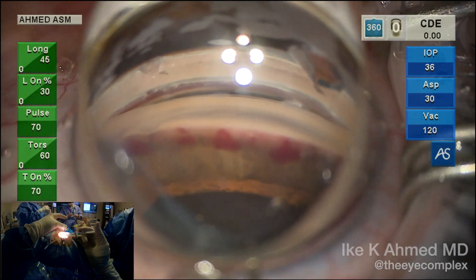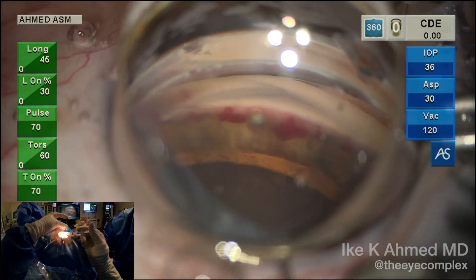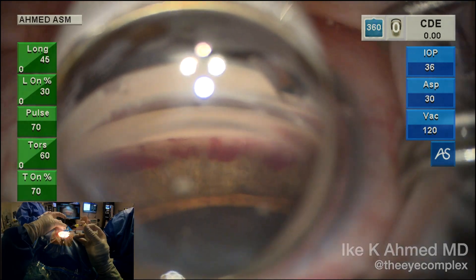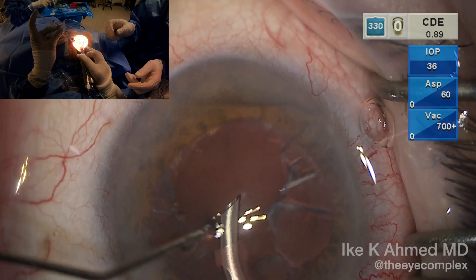Now we're going to provocative testing. We lower the pressure in the eye. Here we can actually see blood reflux emanating from those ostomies, showing proof of principle that we have created full-thickness channels. This is normal to see blood reflux, nicely demonstrating the openings, but it's important that we prevent excessive blood reflux into the eye.